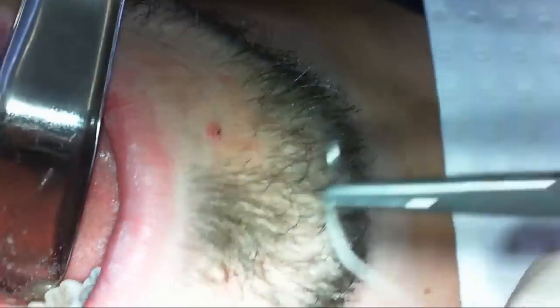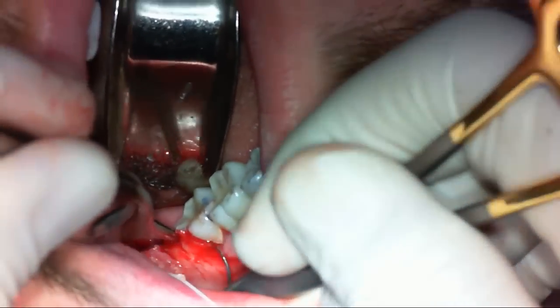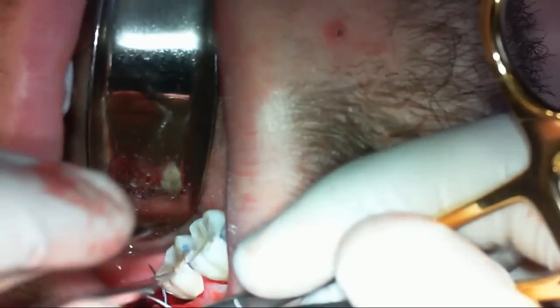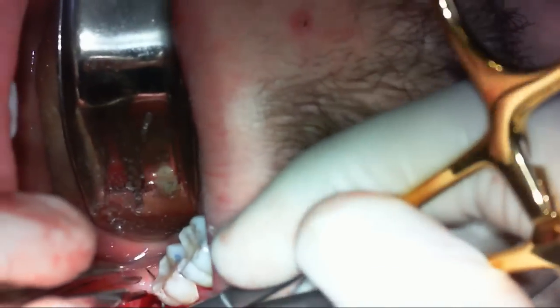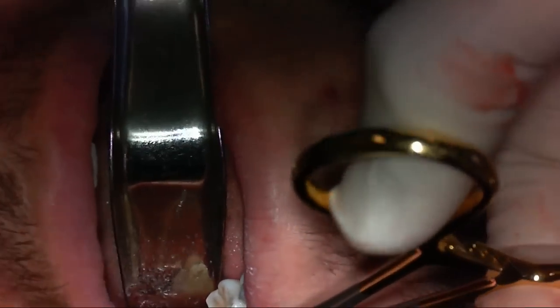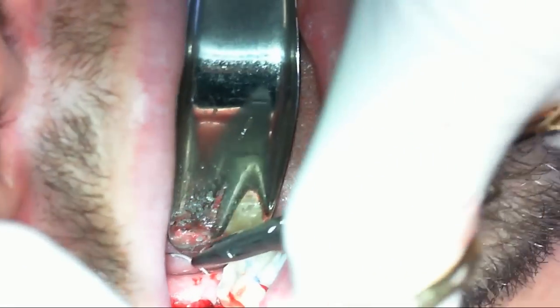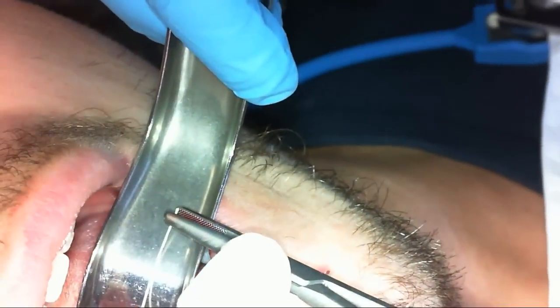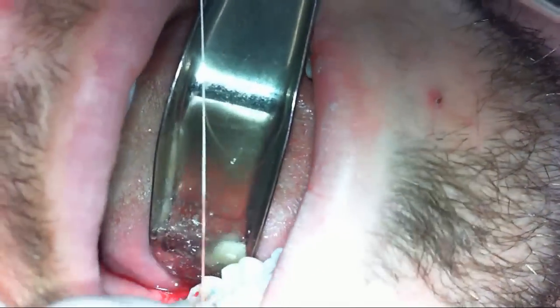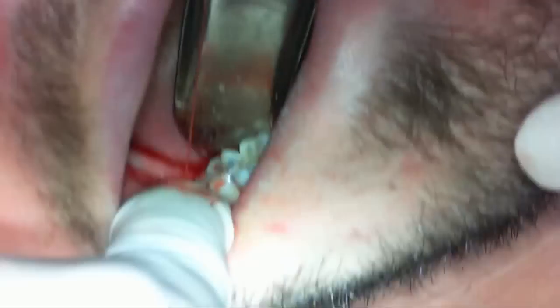A very important tip: I usually place one stitch distal to the seven. It's very important to place it there because you want the keratinized tissue to cover the distal and buccal portion of the crown. We're not aiming for primary closure because the tooth was partially erupted. If the tooth was completely impacted then you get primary closure — if you attempt primary closure on a partially erupted tooth you'll block the vestibule and it can break the stitch easily. Not stitching the distal of the seven risks losing keratinized tissue and getting pockets distal to the seven.